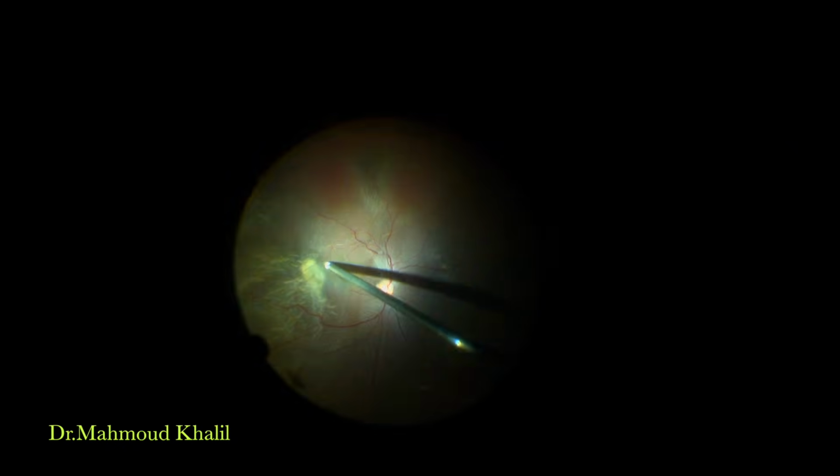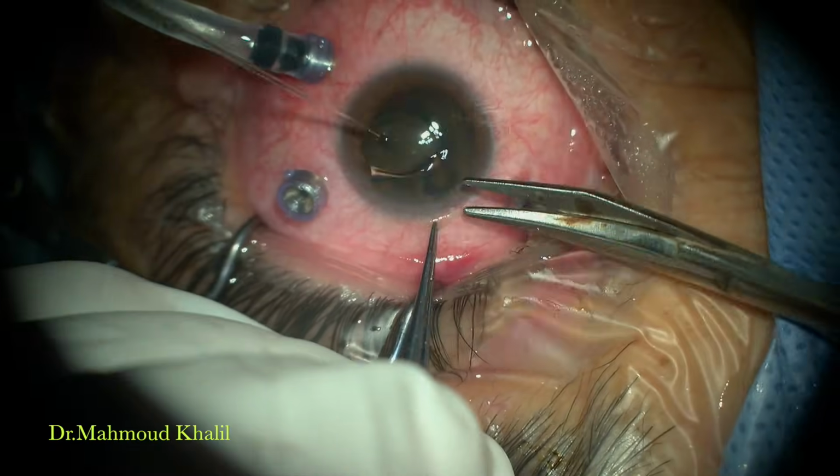The third case is a case just referred for retinal detachment surgery. As we see, there is something running below the macula, and there is a site of entry, so this is a foreign body. Making a temporary retinotomy, retrieving the foreign body from below the retina with the help of the cutter, and then injection of viscoelastic.